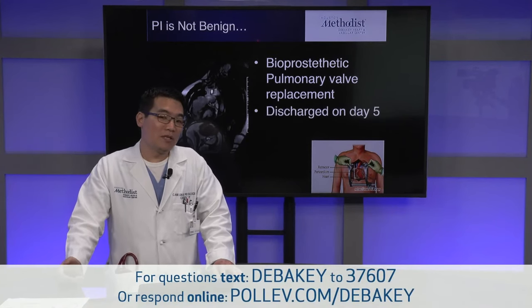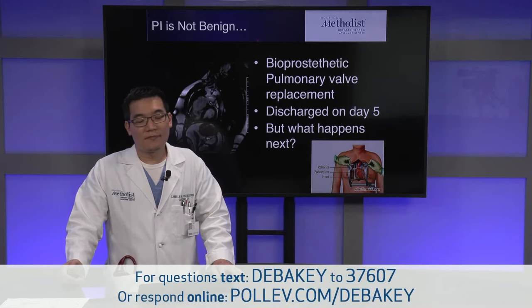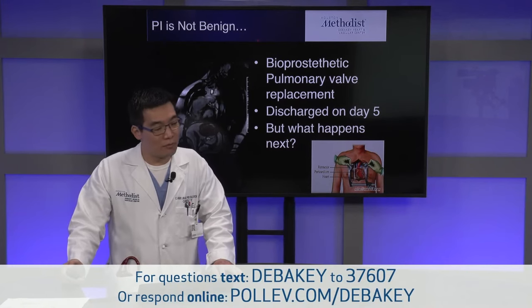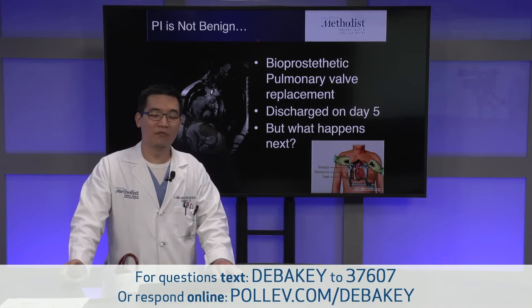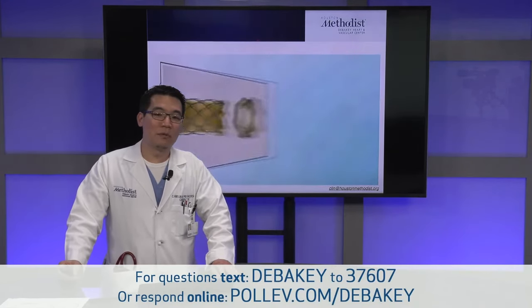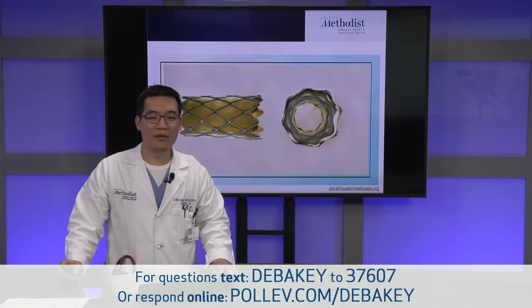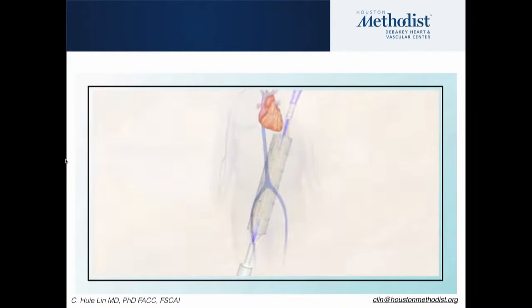And so the patient does great in his postoperative period, and he's discharged within a week. But as I mentioned, the patient will probably need another pulmonic valve replacement anywhere between age 46 to 50. And that's where transcatheter valve technology becomes extremely powerful. So this is one of the two FDA-approved transcatheter valve technologies for the pulmonic valve in the United States at this point. This is called the Melody valve.